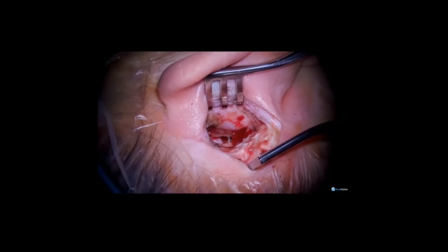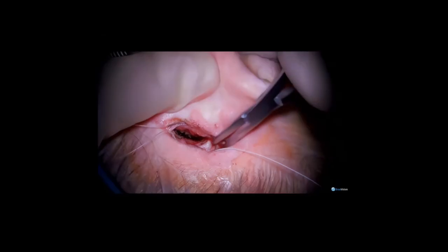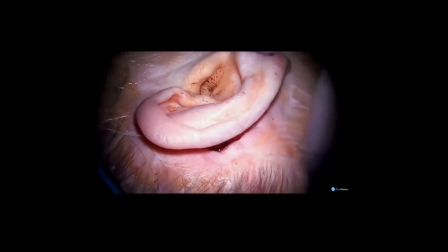And given that the prosthesis is in a good firm position, I typically return the patient to full activities without limitations, especially when a partial is used with an intact stapes superstructure.